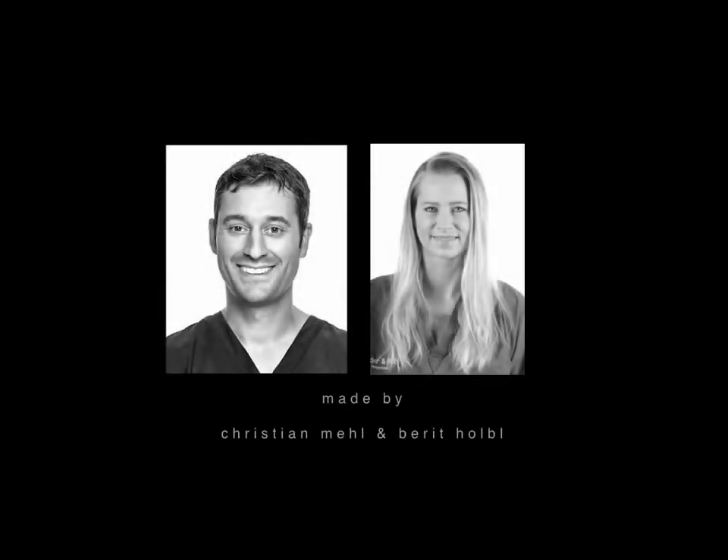Welcome to our implant library. Today is another very beautiful case showing Maryland bridges. Great thanks to master dental technician Barrett Holbel who has done this work in our lab in Munich.